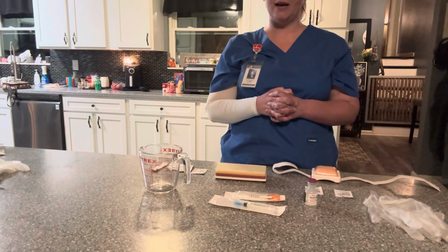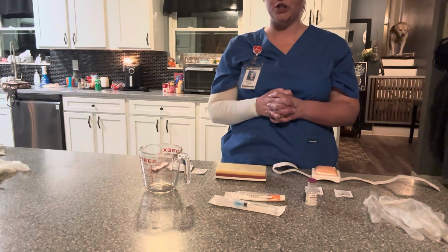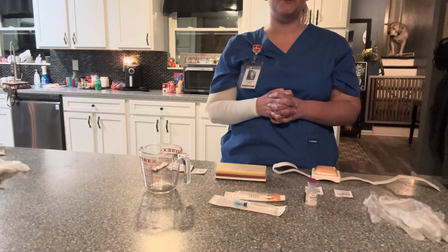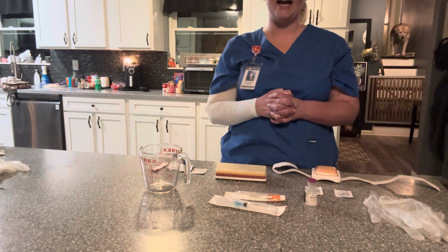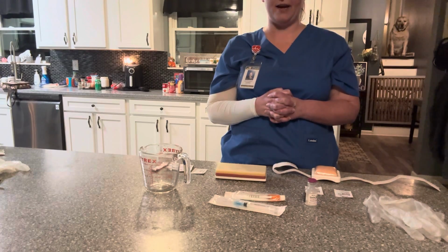I would check vital signs. I would check my patient's glucose for an abdominal subcutaneous injection. I would give the correct information to my patient, such as purpose and action of the medication and what signs to look for for any side effects.